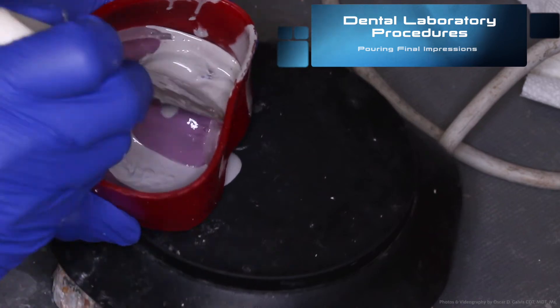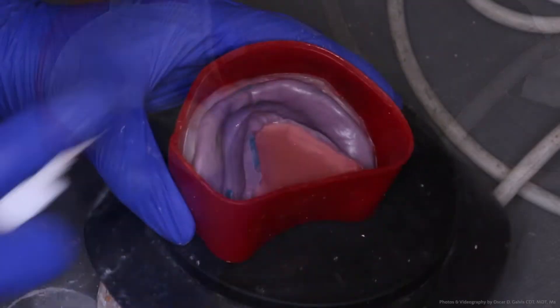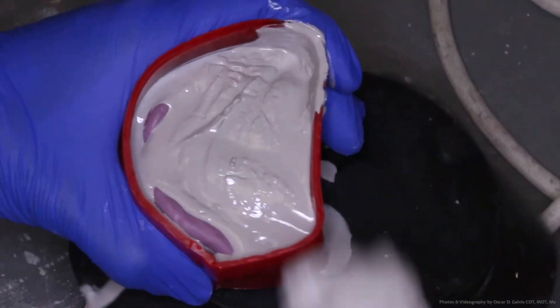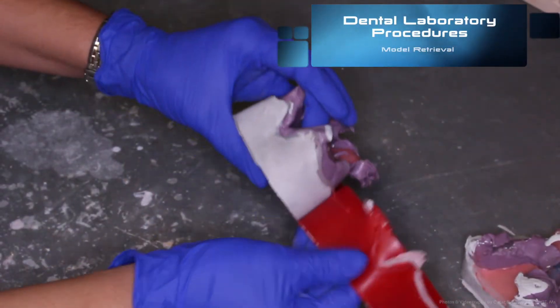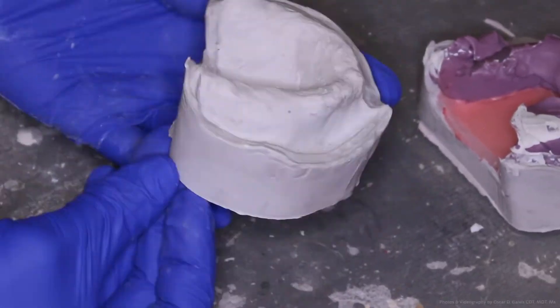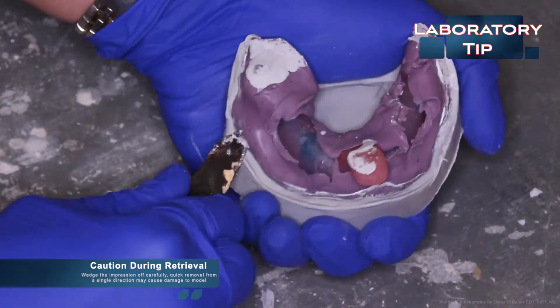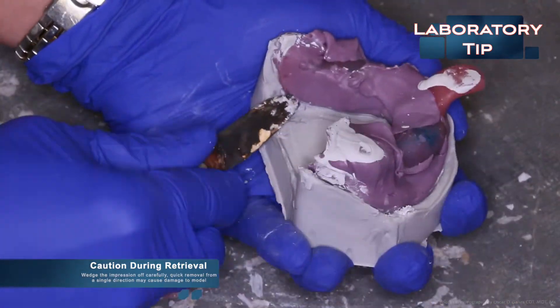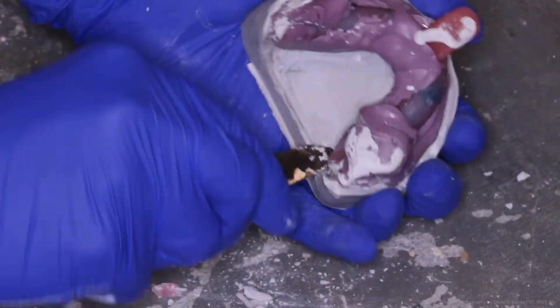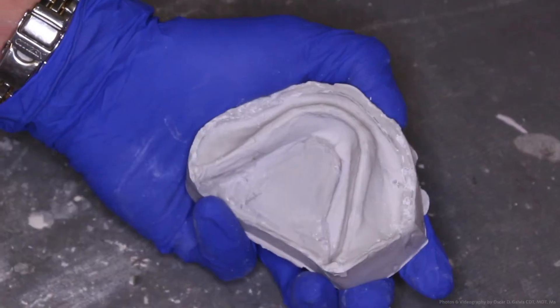Once everything has been tested and sealed, we can then begin pouring the final impressions. Once the final impressions are poured, wait until they are completely set and remove the boxing and beading wax. Once they are completely set, you can retrieve the models from the impressions. Take caution during the retrieval process. Wedge the impression off carefully. Quick removal from a single direction may cause damage to the model and important anatomical landmarks. Once the models have been retrieved safely, they can be taken to the model trimmer and trimmed and ready for the next step in the denture fabrication process.